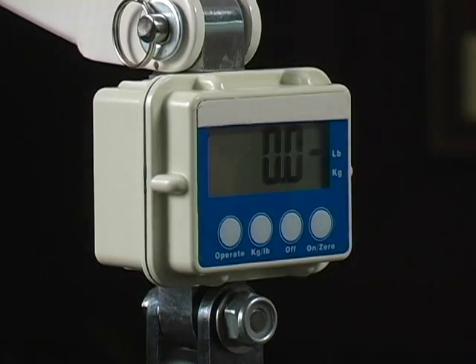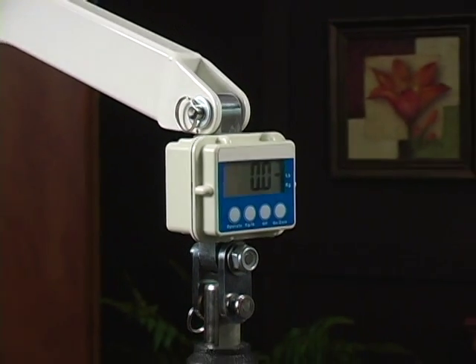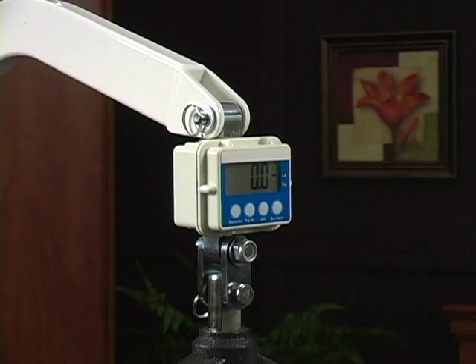An optional digital scale is available. The scale is easily attached to Lumex lifts and minimizes resident risk by eliminating an extra transfer to a facility weighing device.